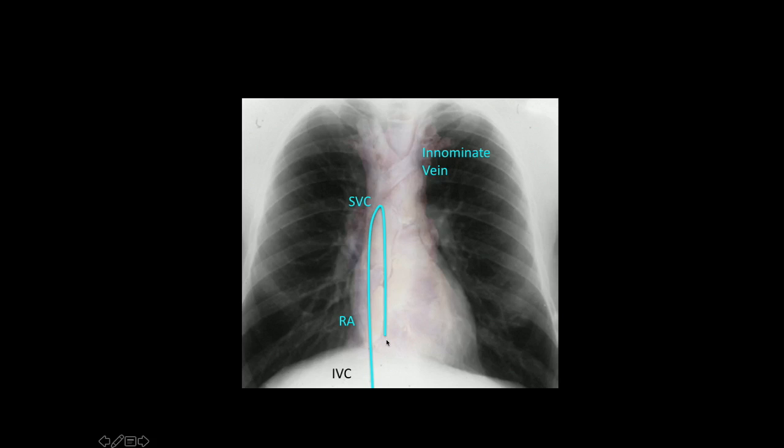So if it's coming along the spine and then ends up anterior, that's an interrupted IVC, coming up the azygos and entering the SVC and RA. If on the lateral, this is more anterior and then goes posterior, then you went up the IVC, RA, SVC, and then you went into the azygos and down the azygos. So the azygos is posterior to the right atrium, is the bottom line, okay?